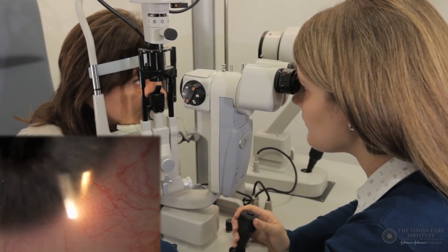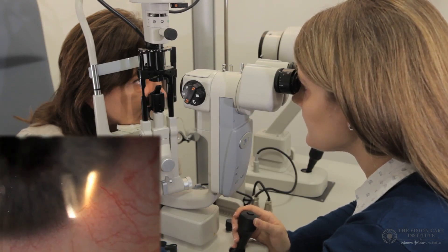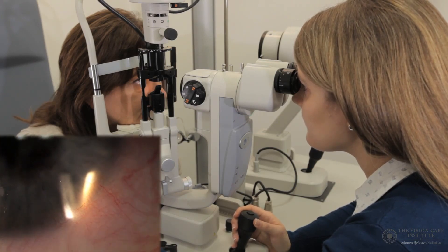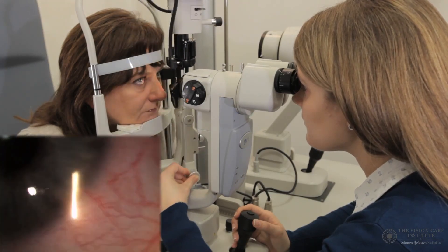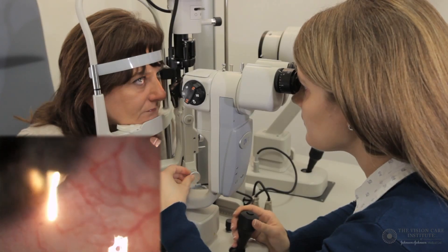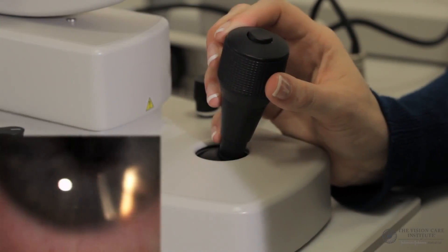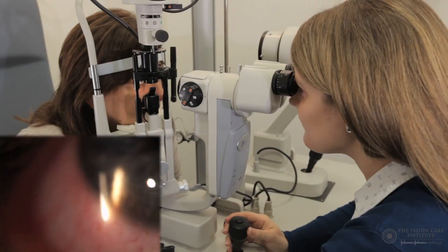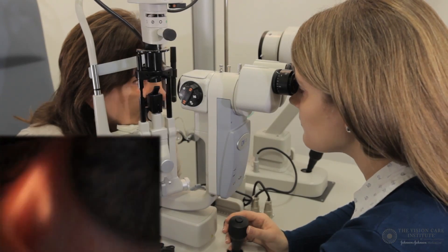A key element of this technique is to cross illuminate. So when we are looking at structures on the nasal cornea, we must make sure that the illumination system is on the temporal side, as it is here. If the illumination is on the same side, that is on the nasal side, the glare that is caused will reduce the visibility of those blood vessels. Here, as we move it back to the temporal side, the blood vessels are rather more visible. If we want to view the temporal cornea, then all we have to do is move the illumination system to the nasal side so we are cross illuminating, thereby making the corneal blood vessels more visible as we can see here.